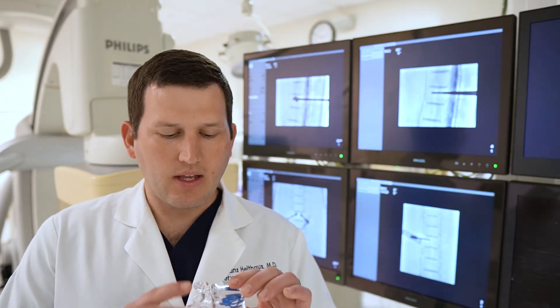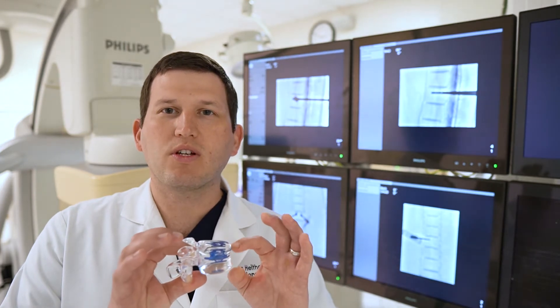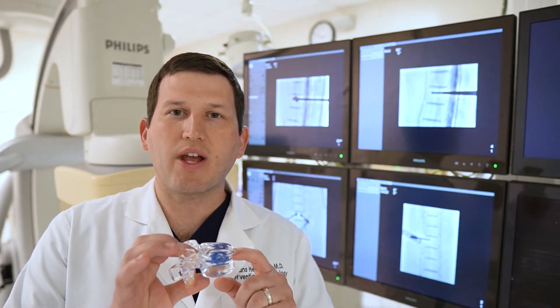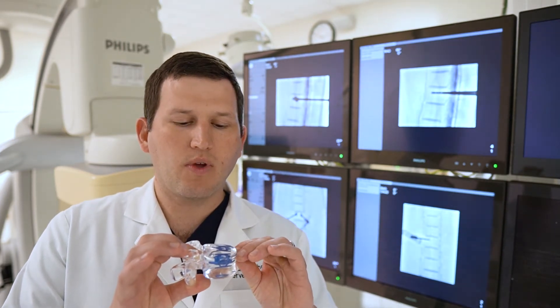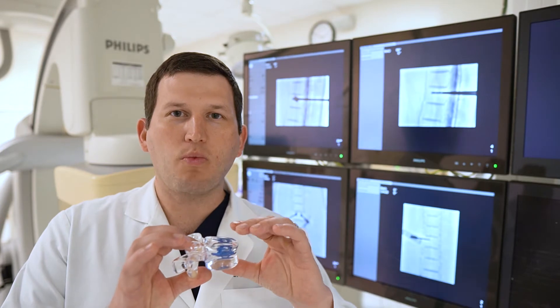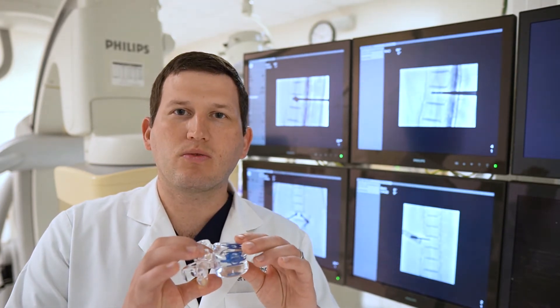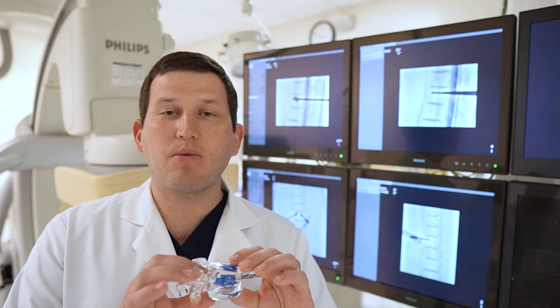Spine Jack is different. As the spine compresses, we want to restore that vertebral body height. So we insert these two titanium implants into the spine — they're almost like scissor jacks for your car. As we open the jacks, they actually open the bone back up, restoring the bone into its original position. Then we cement the implants in place, stabilizing the bone.